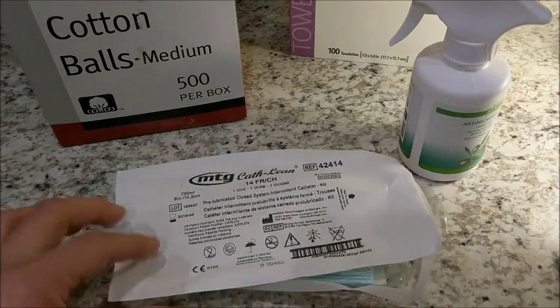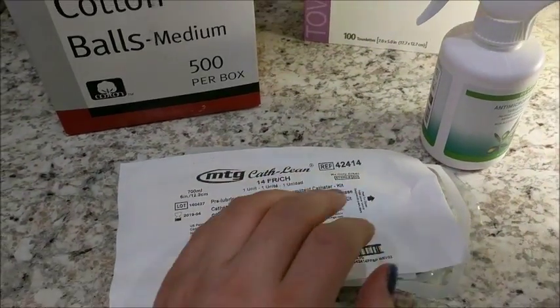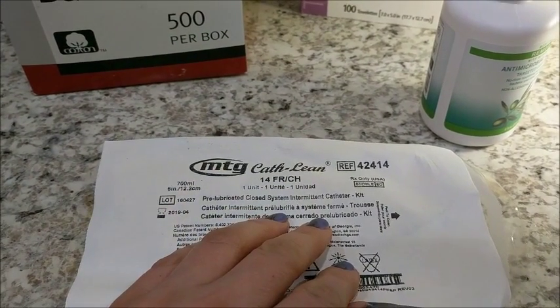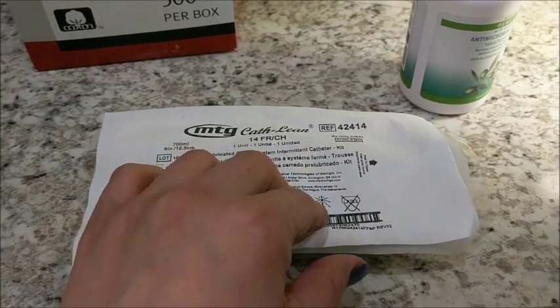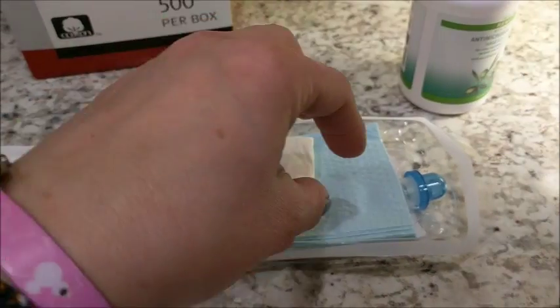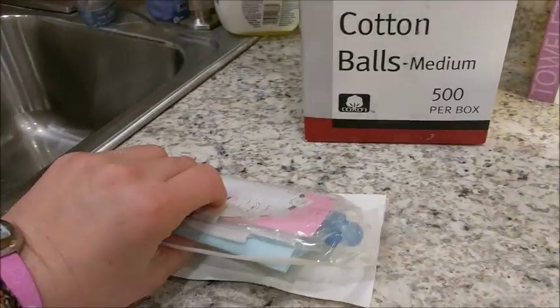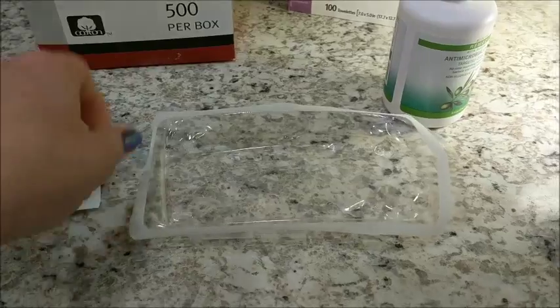Getting into this, you can see I just peeled off this top here. We don't typically say sterile in a home environment, which is pretty much what these are used for. We say clean, because nothing's sterile unless you're in a surgical environment, but you want to keep everything as clean as possible. I've already washed my hands and I've peeled this back, so everything in here is clean. I'll typically take this and flip it over so that I have a nice little tray that is clean.